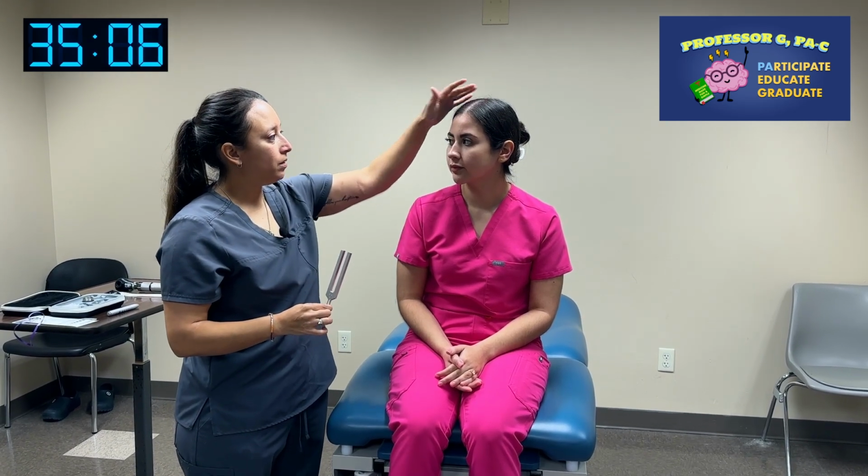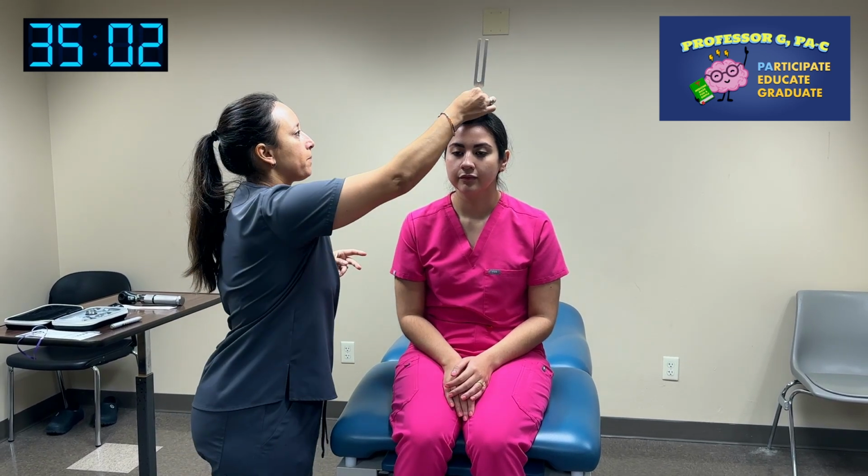Okay. So next up, I'm going to use a tuning fork. It's going to make a noise, kind of like what you can hear here. I'm going to ring it, and I'm going to place it on the top of your head up here, and I want you to tell me if you can hear it the same on both sides, okay? Yes. All right. Now I'm going to ring it. I'm going to place it behind your ear. You're going to hear it. Once you stop hearing it, say yes. I'll move it in front of your ear, and then say yes when you stop hearing it again, okay?